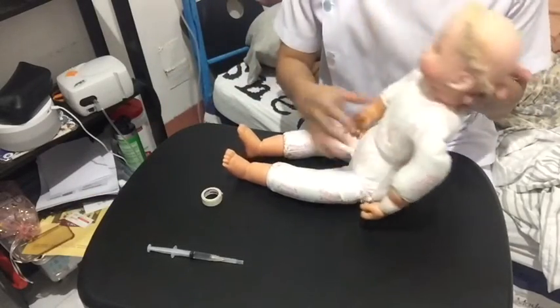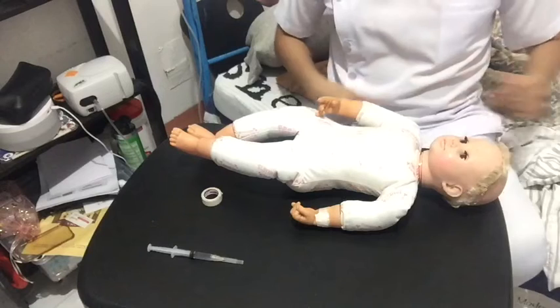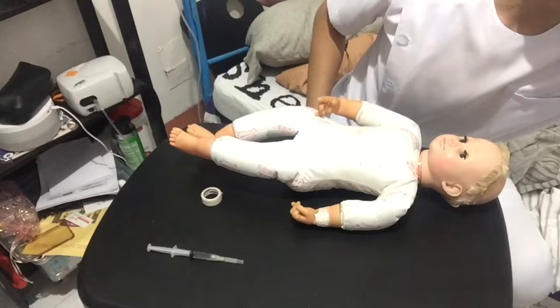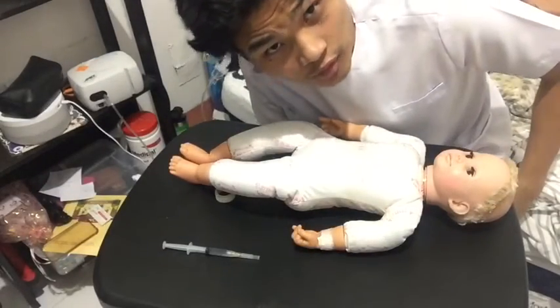Now, after teaching the client the proper way of breathing for nebulization, we're going to be assembling the equipment. Now we're going to start the performance phase.